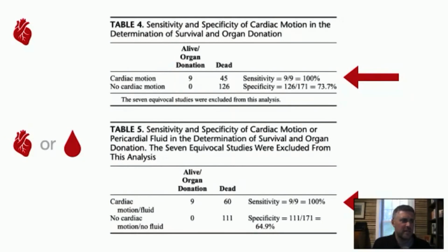And this falls into the practice pattern that we see happen with the trauma service, right? They get in there, we have a potential injury to the chest, a GSW of the chest, whatever. We scan them, no heartbeat. Probably not going to make it, and they're probably going to call it, right? And the data here would certainly support that practice.